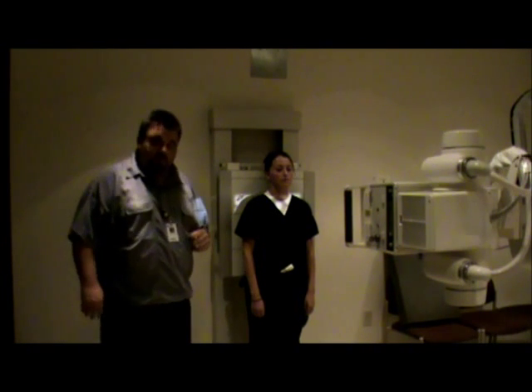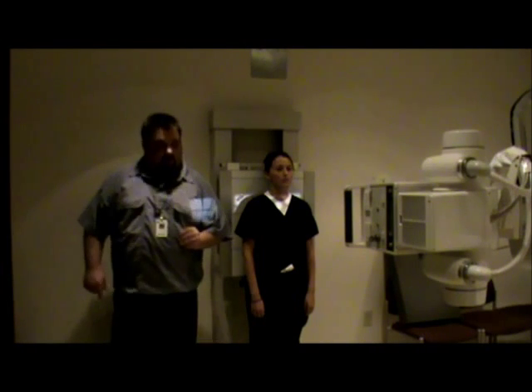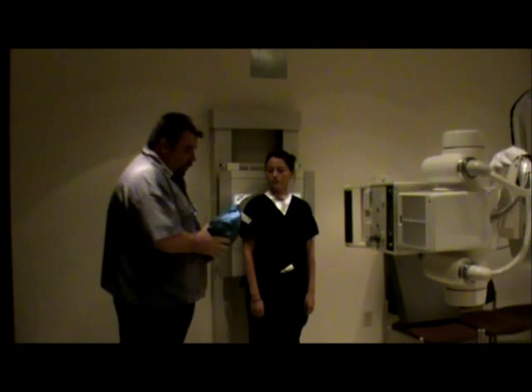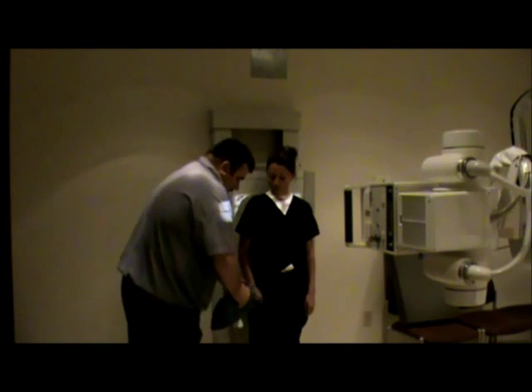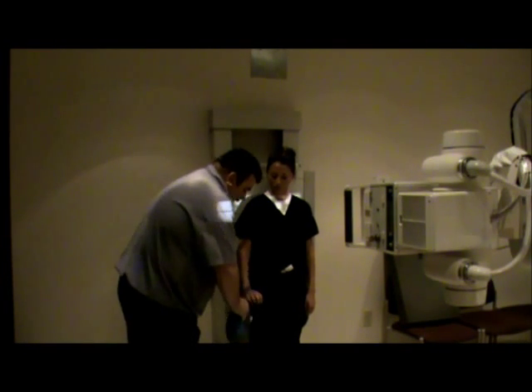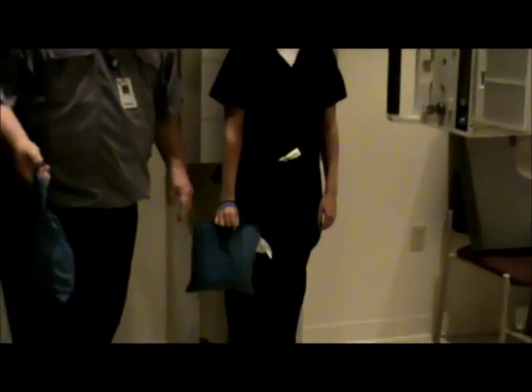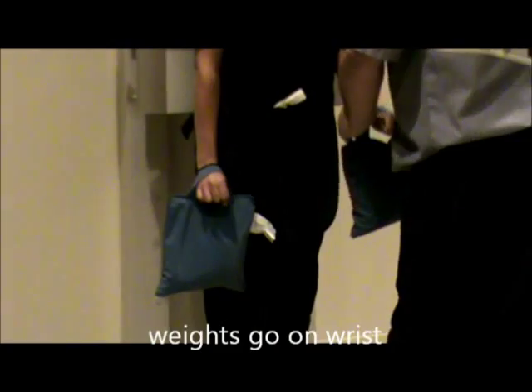We do go to the radiologist and have him look at the films. He says everything is okay, we'll come back. We're going to use these weights and we're going to put them — put your hand here for me. We're going to actually let these rest on her wrist.